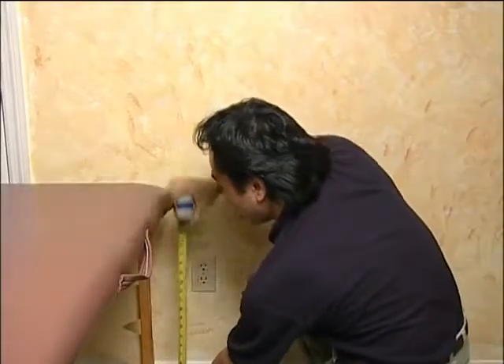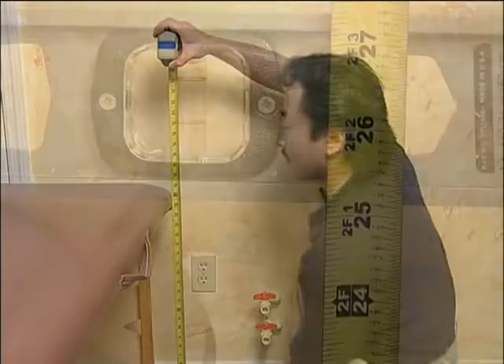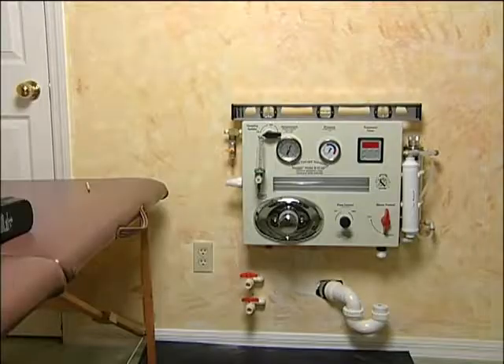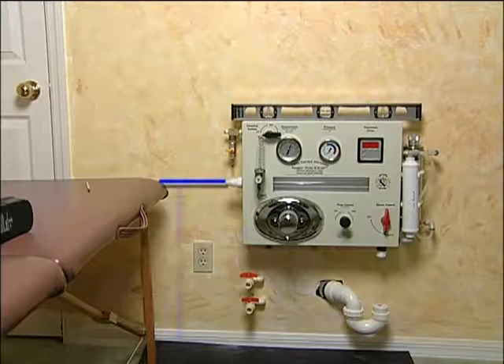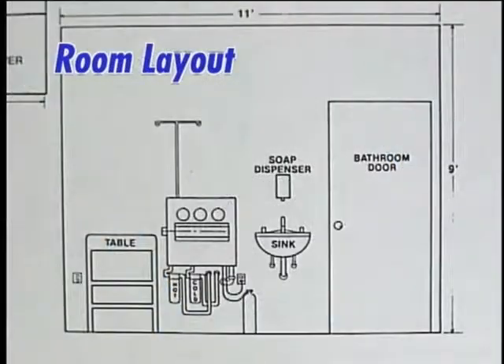We realize all installations are different, so the one key element to keep in mind is that your treatment table dimension from floor to top should equal the same dimension of the instrument's waist connection level. If your treatment table is only 25 inches, the instrument's waist connection must also be 25 inches. Please read the instruction manual along with the suggested treatment room layout page.